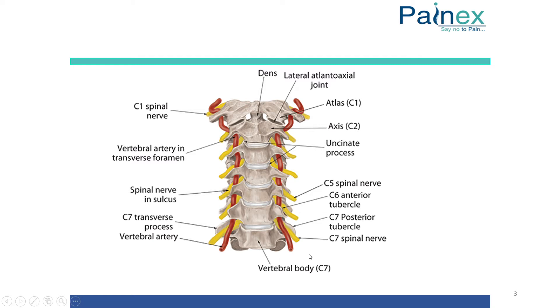So how do we identify C7 and C6? At C7 there is no anterior tubercle and the entire artery can be seen throughout — the anterior tubercle of C7 is very much rudimentary. While at C6 we can see a prominent anterior tubercle, which is also called the Chassaignac's tubercle.